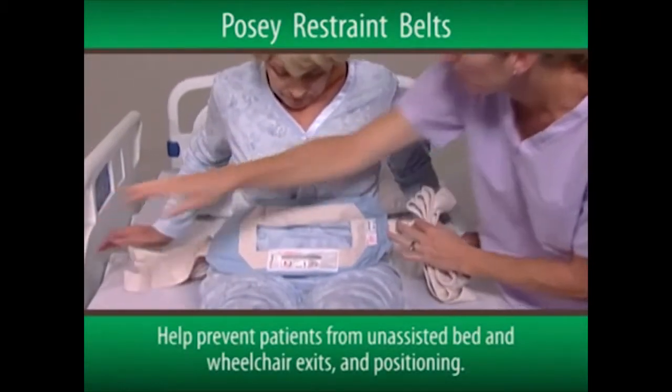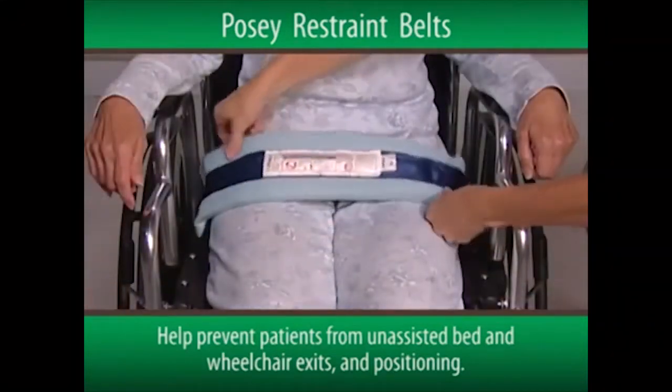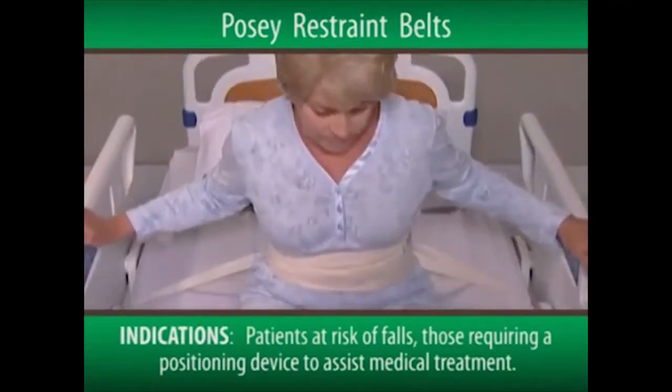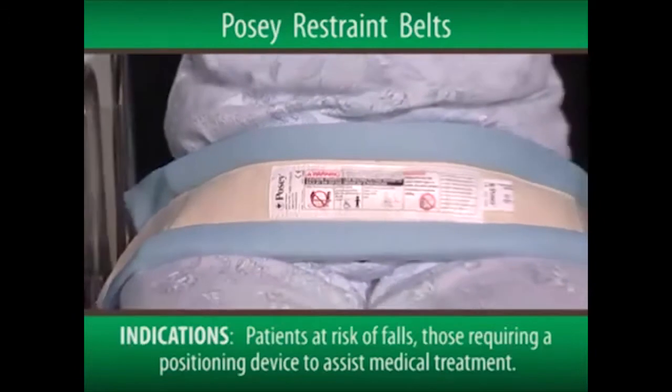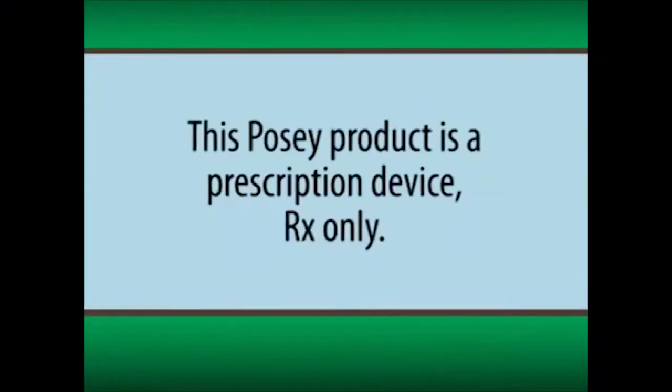The POSI Restraint Belts are used to help prevent patients from unassisted bed and wheelchair exits and positioning. They're indicated for patients assessed to be at risk of injury from a fall, or those requiring a positioning device to assist medical treatment. It's important to note that this POSI product is a prescription device, RX only.